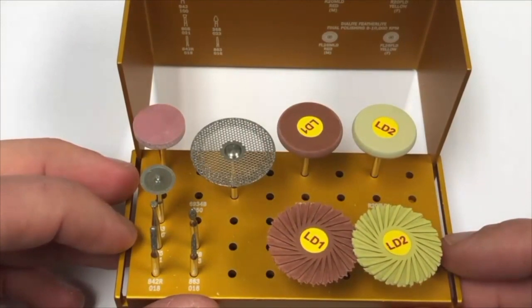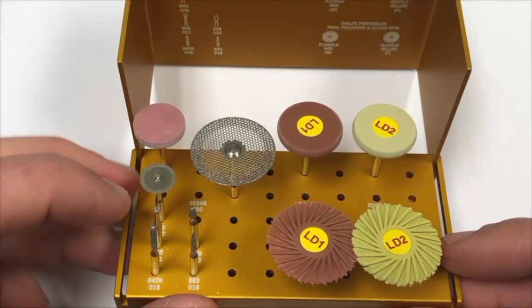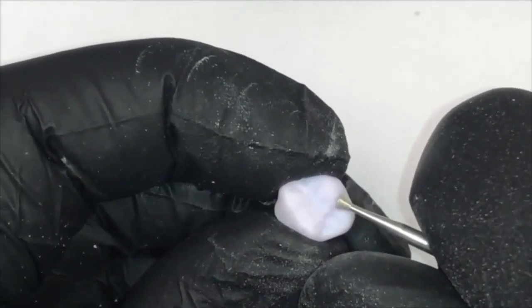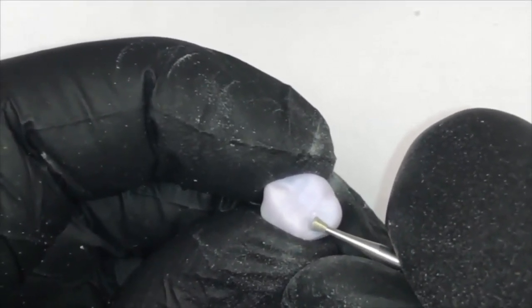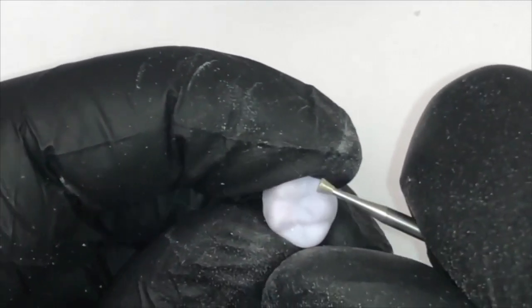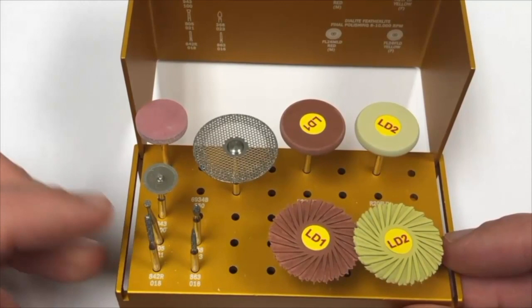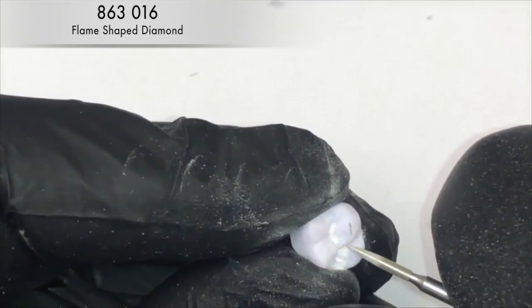When posterior ceramics are milled, often the milling burrs do not provide enough sharp anatomy. To define posterior anatomy, the 805021 inverted cone diamond is ideal. On this posterior molar, the Brassler inverted cone diamond is very effective to sharpen the anatomy, especially the fissures and anatomical grooves. Care must be taken not to deepen the grooves excessively and weaken the restoration. Final definition of anatomy can be achieved with the 863016 pointed Brassler diamond, which is effective in defining the ridges and cuspal areas of the occlusal surface.